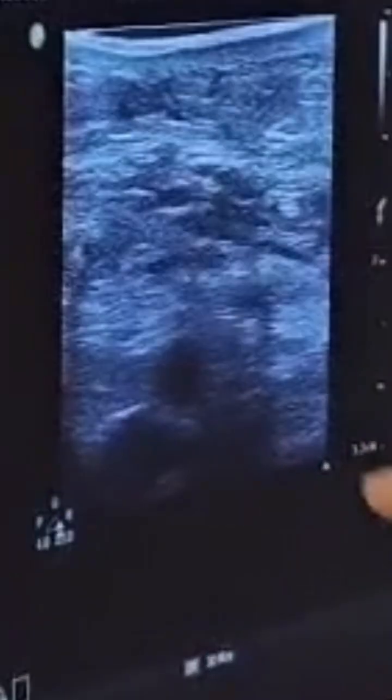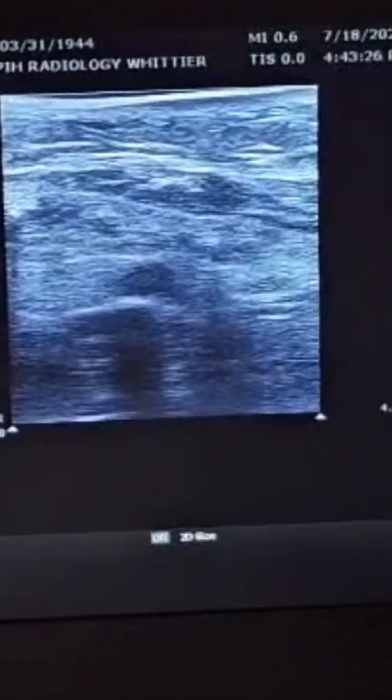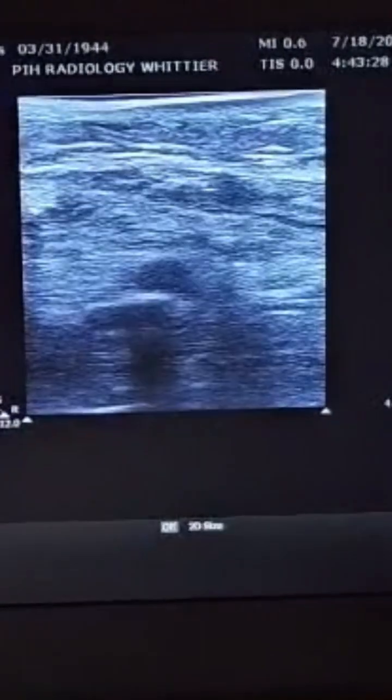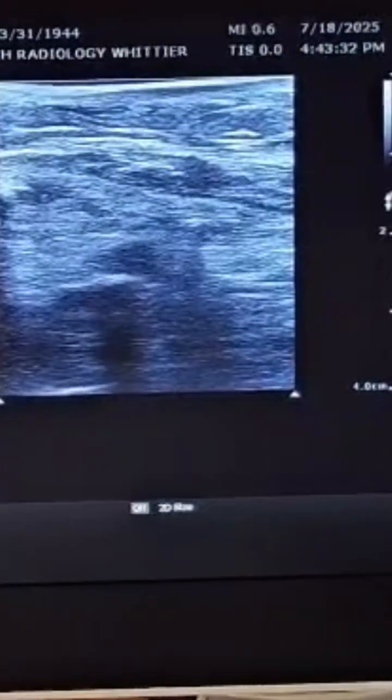You can actually see the popliteal artery and the vein right on top of it, just like as if they were prone. Some people assume that you're going to get transverse access, but we're going to get access in the long way.